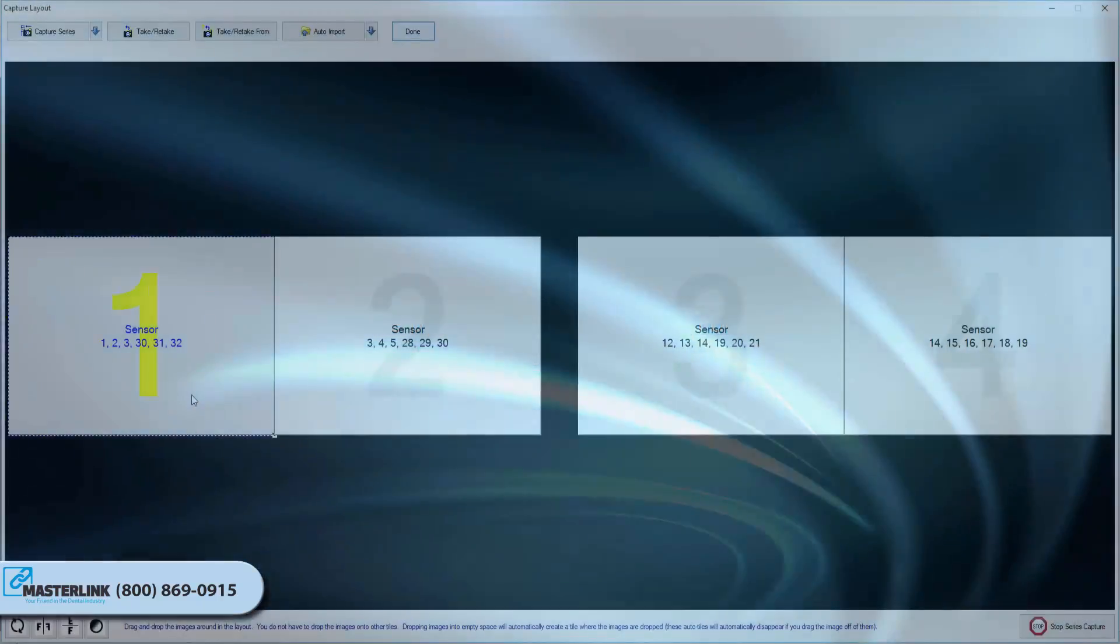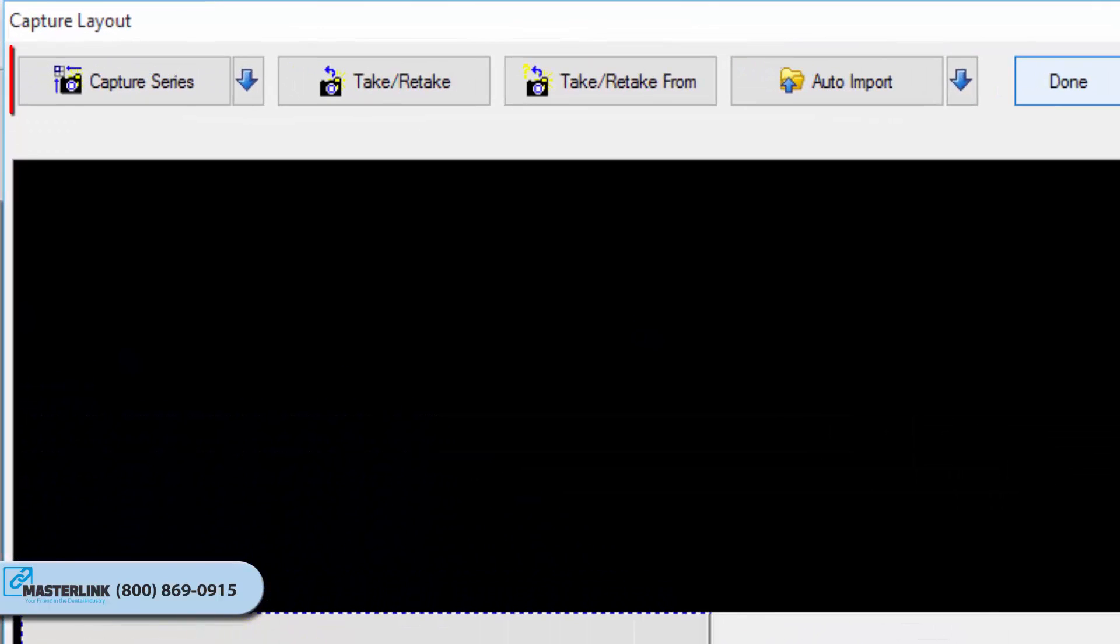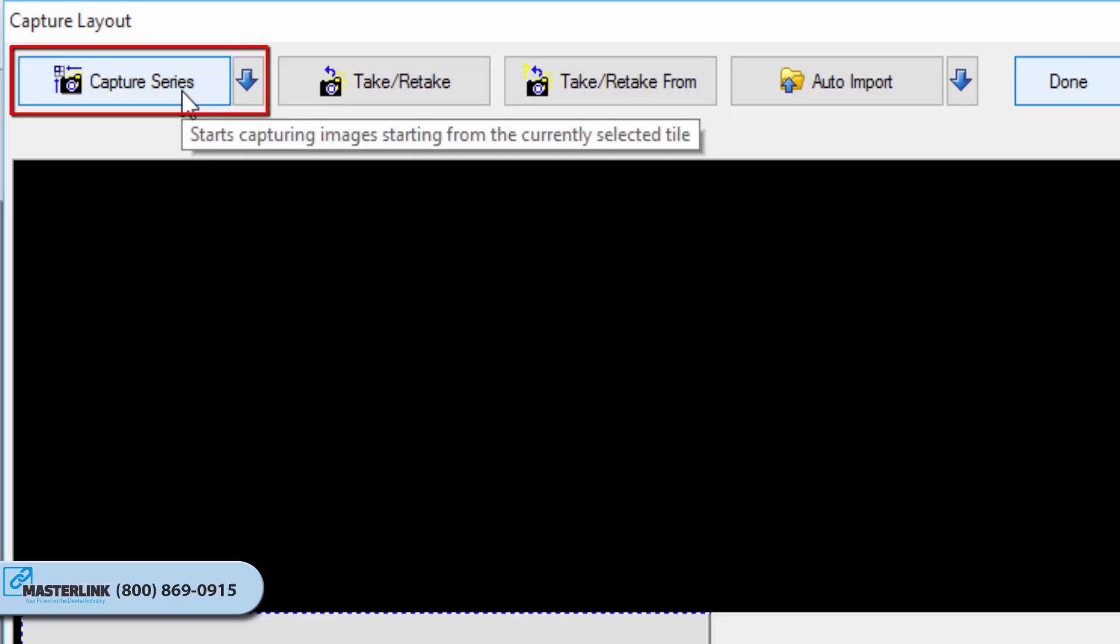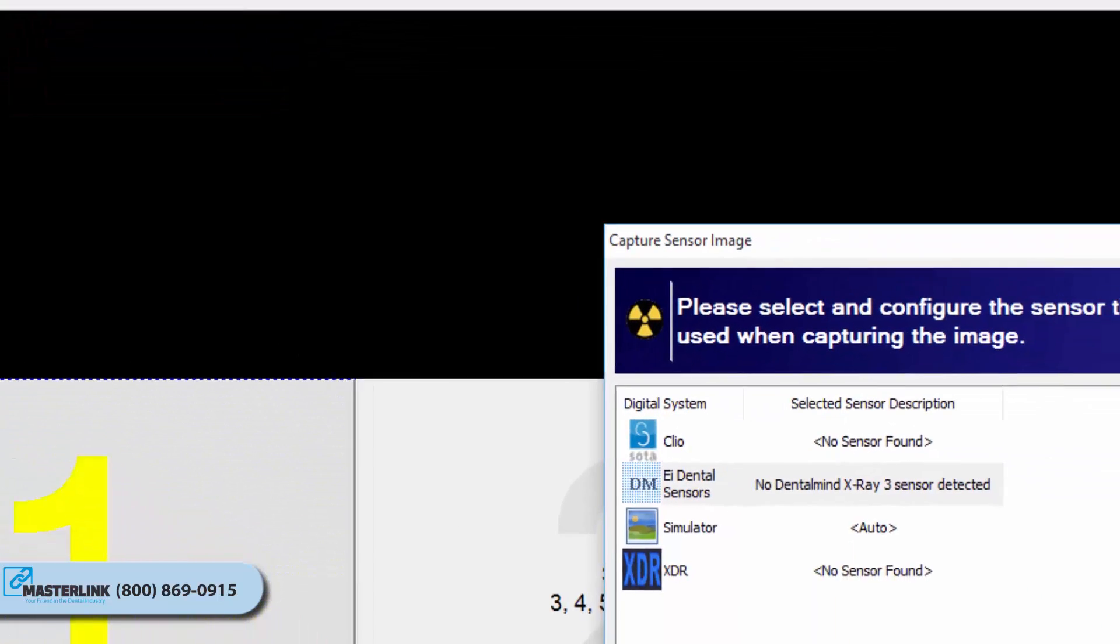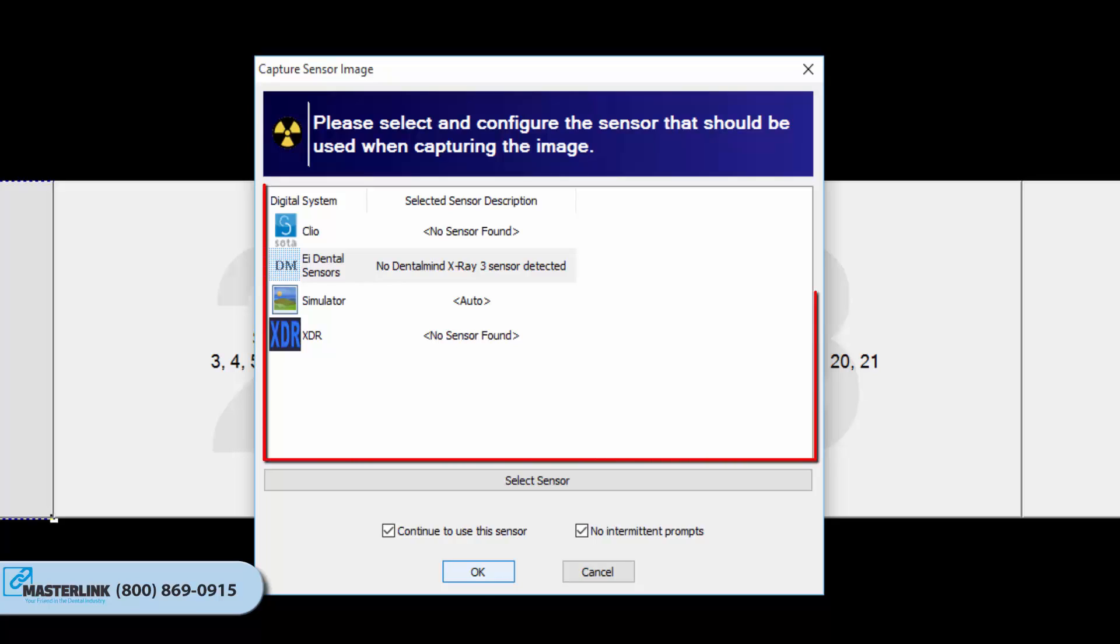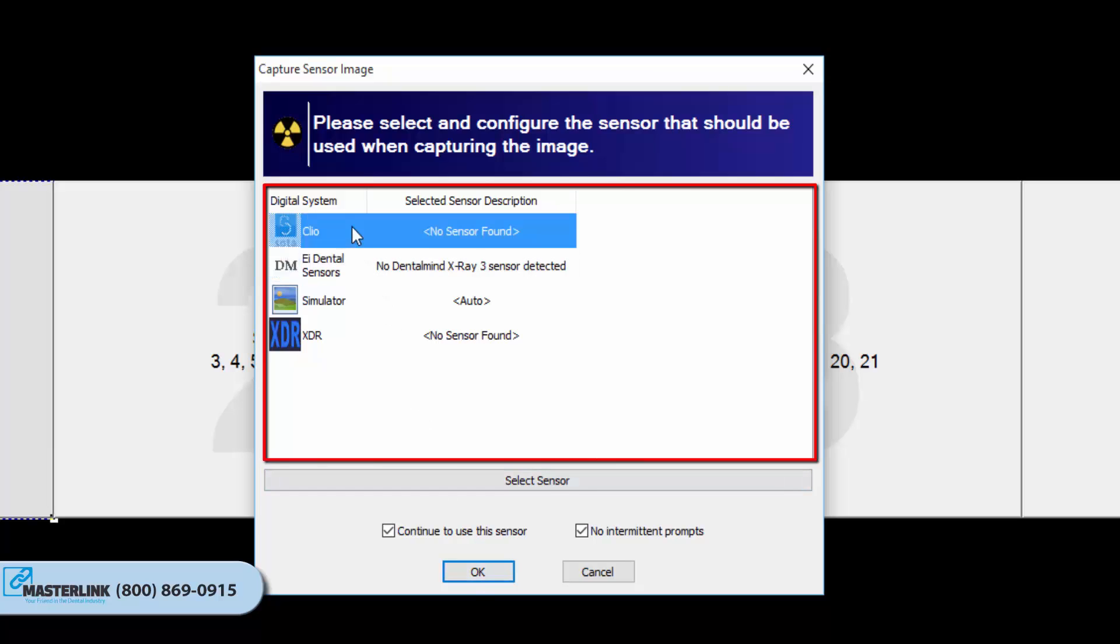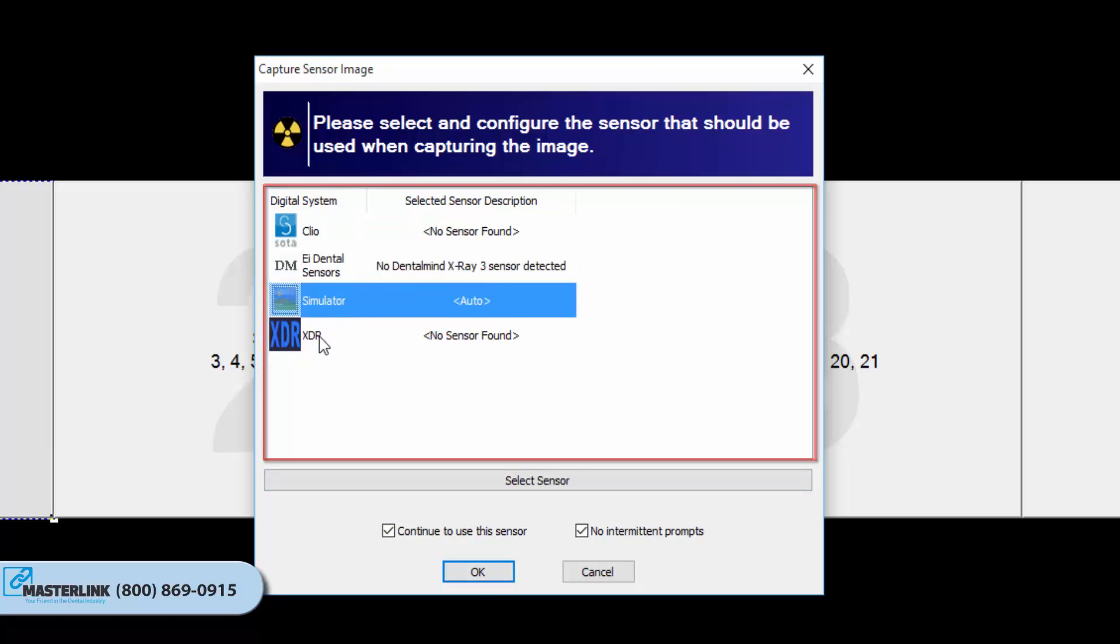Click the Capture Series button in the top-left portion of the Capture Layout window. If a layout has been configured to use a specific hardware extension, that hardware will ready itself for acquisition, and the series capture can begin. If no specific hardware extension is predefined, the user will be prompted to select from a list of available Capture Hardware.